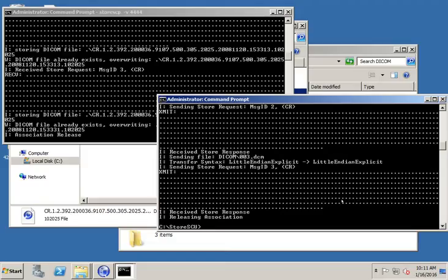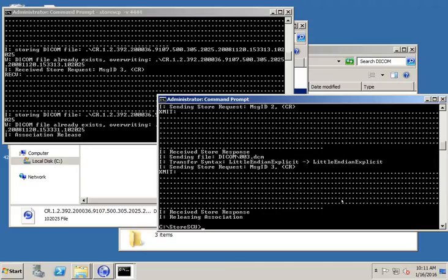So now it'll send the file, but it will call itself more specifically SCU and call the person it's sending to the SCP. If you forget those options, you can just type the command, hit enter, and it'll show you all those options. So you would see that in the list, the dash AET and dash AEC. And it'll tell you which is the called and which is the calling AE title. So of course, called is the AE title that you're sending to, and the calling is the AE title you're calling yourself.